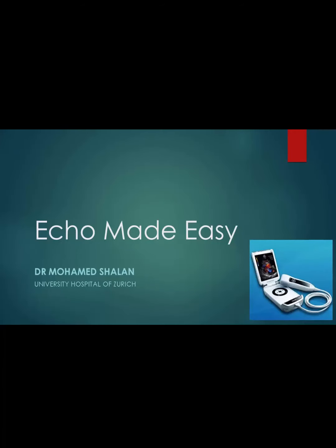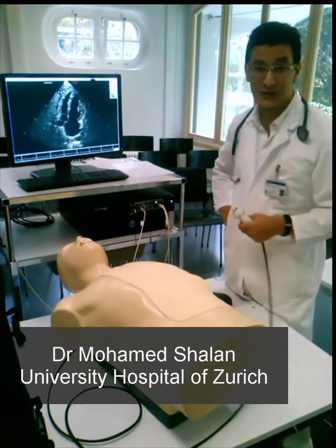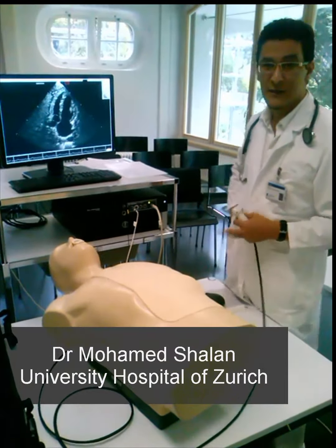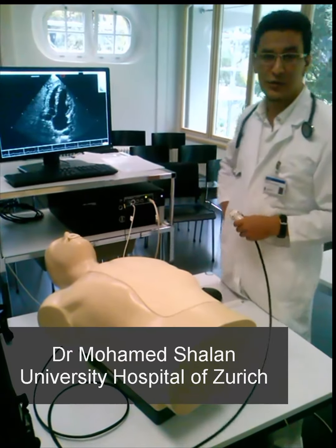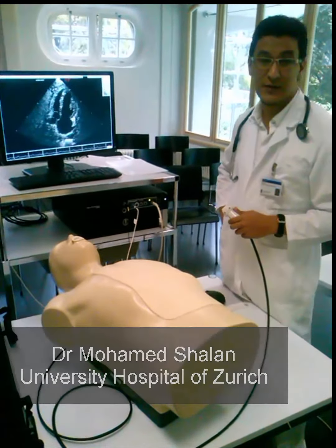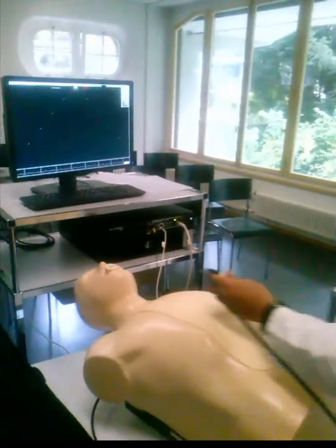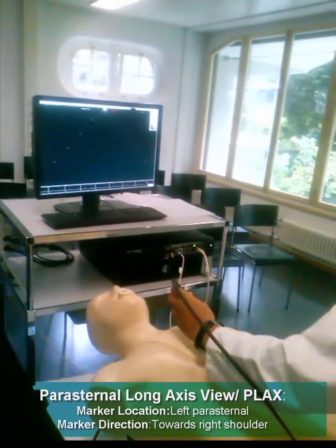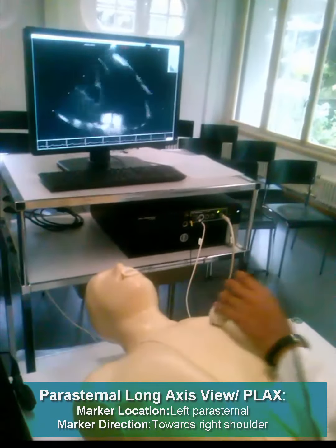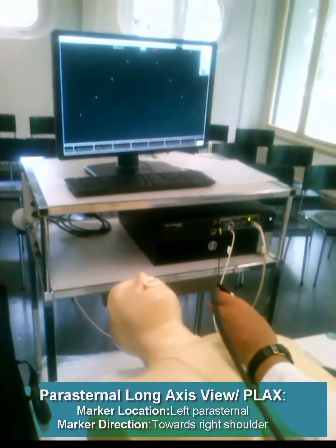Today we will discuss how to use an echo machine with this simulation to make it easy for beginners. Dr. Muhammad Chalan, University Hospital of Zurich. We will study the normal echocardiography. We will start from the left of the sternum area, as you see — the marker here will be in the right shoulder.